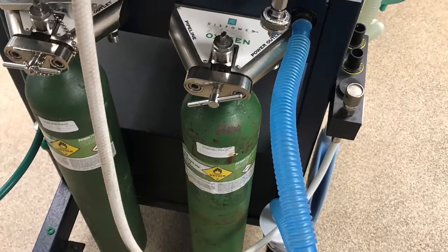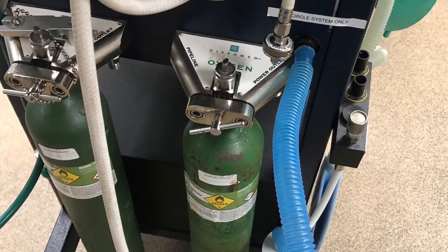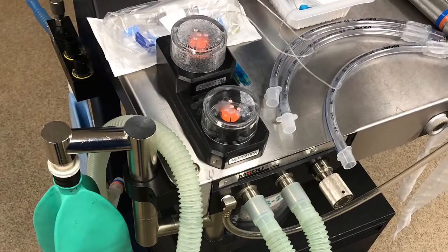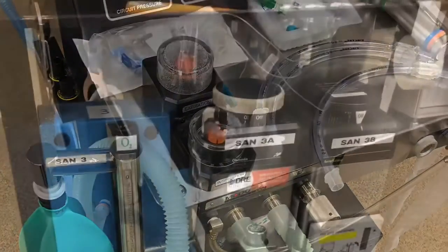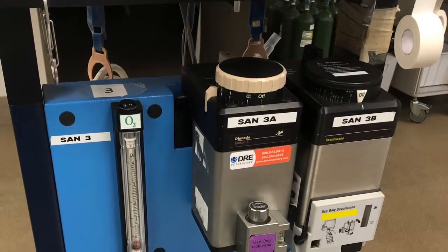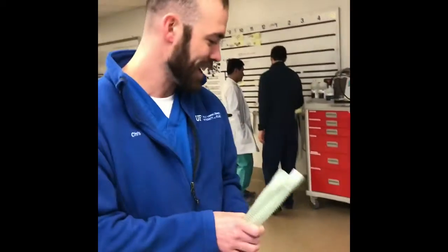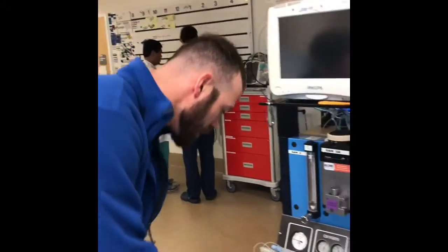The E-tank on the left is connected to the pressure regulator on the front, which tells you how much pressure is in the tank. It's also connected on the back to the pressure regulator valve. That valve is then connected to the flow meter, which is at the top left of the machine.